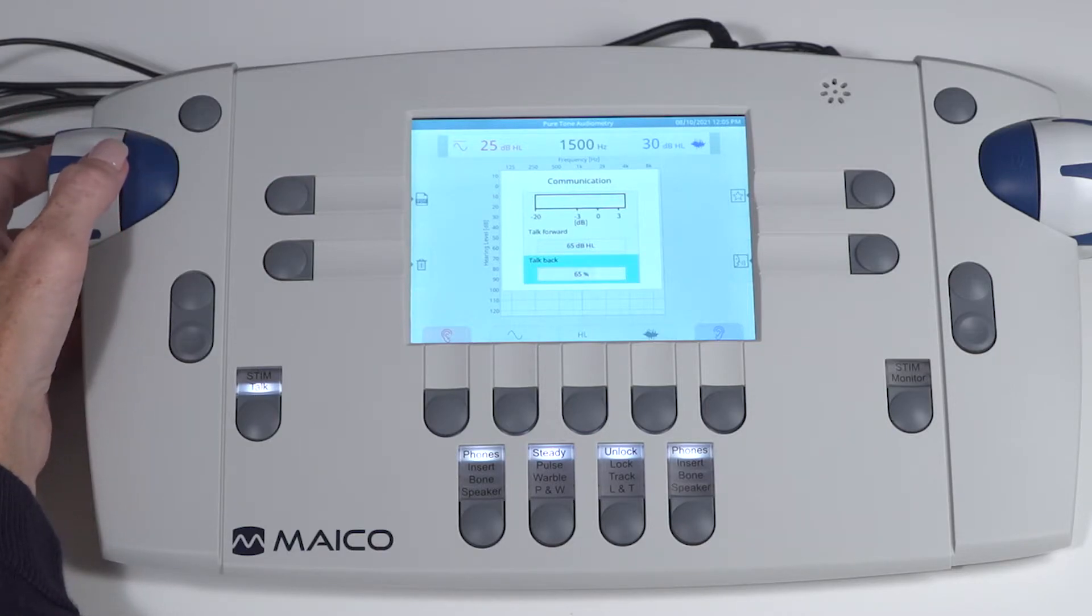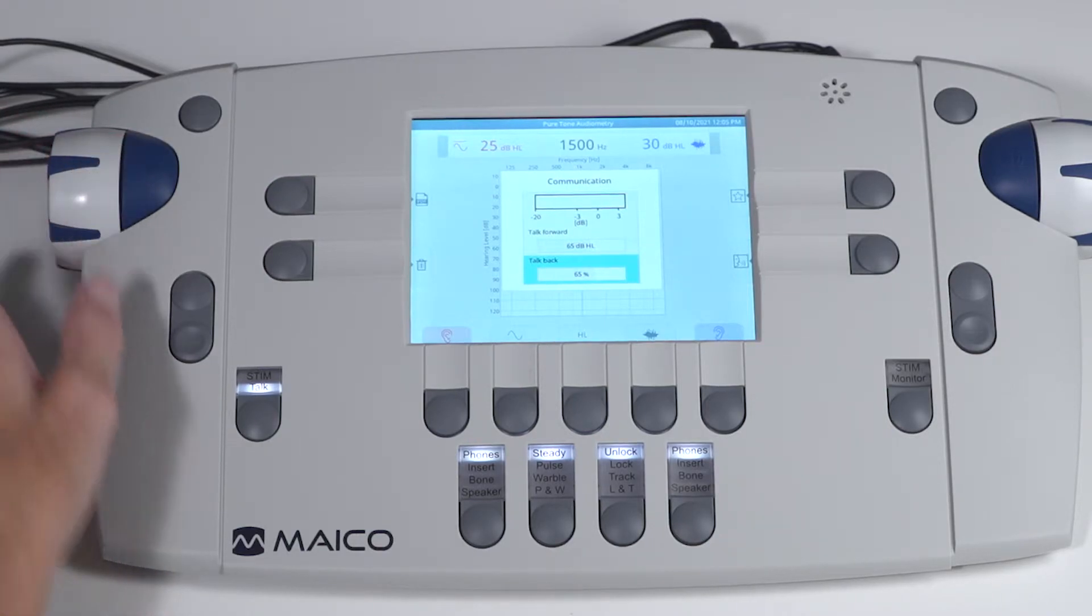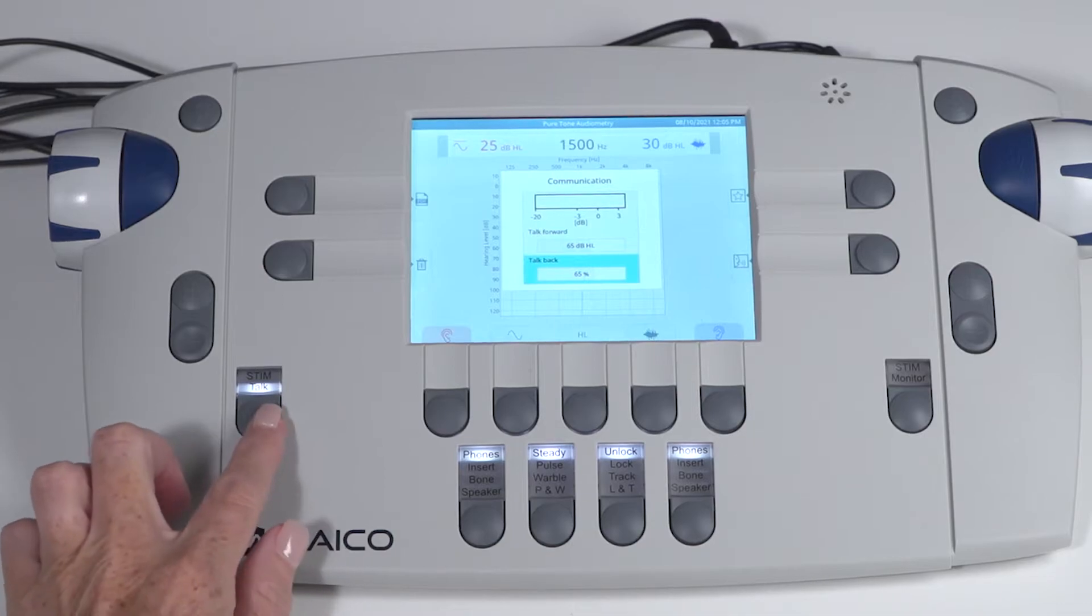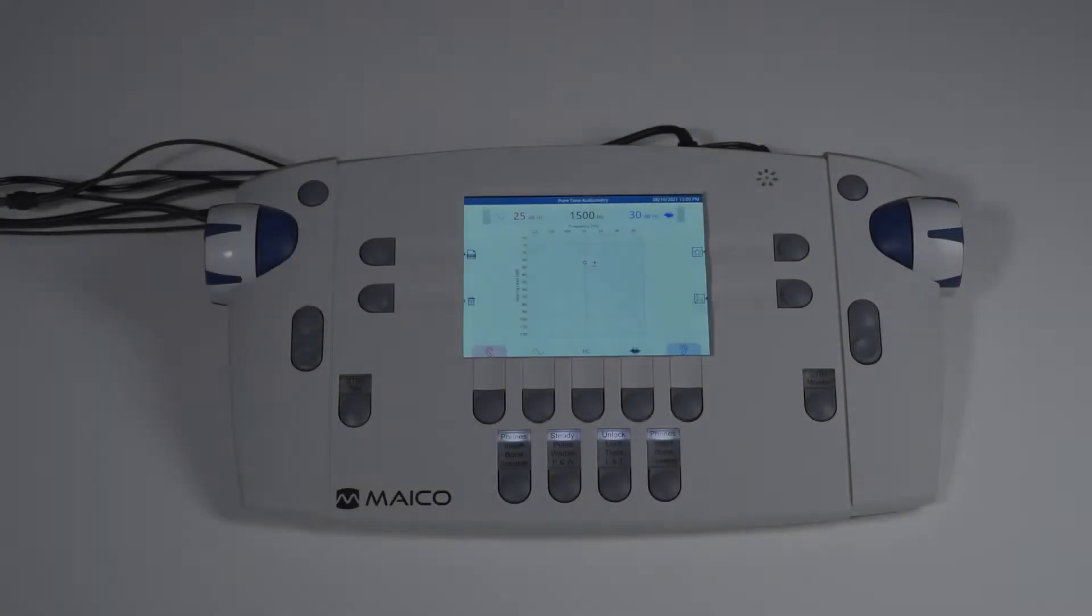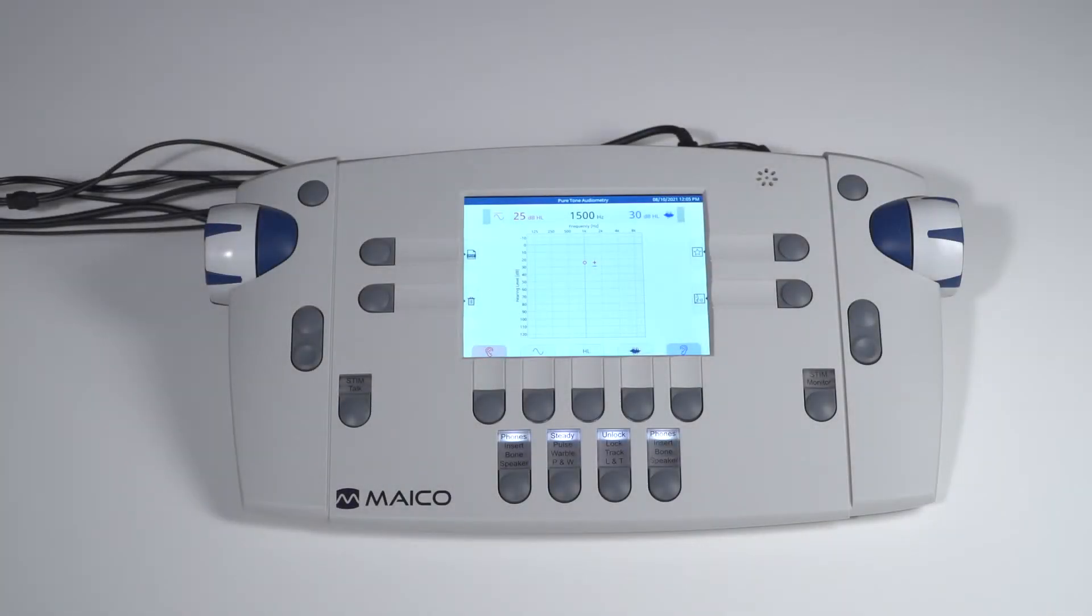To return to the test screen, press and release the stim talk key again. Default settings can be tailored to your preference in the settings menu. Let's look at the bottom row of keys.